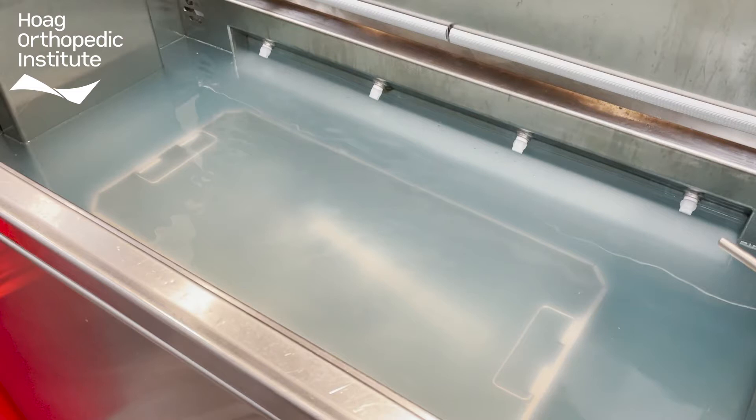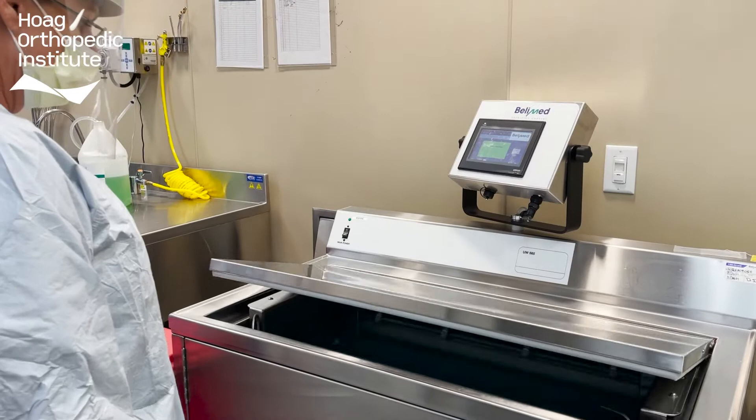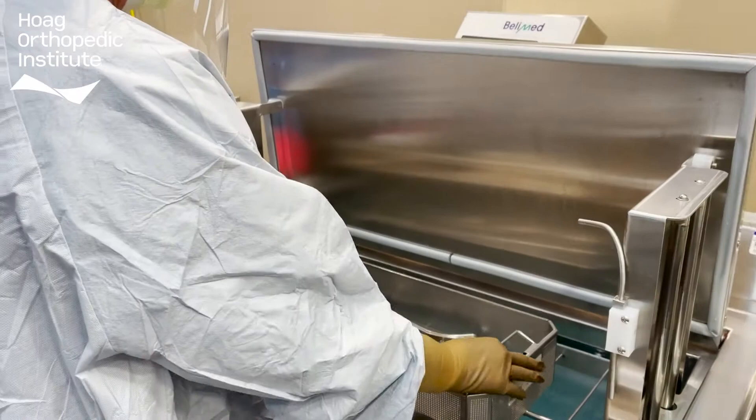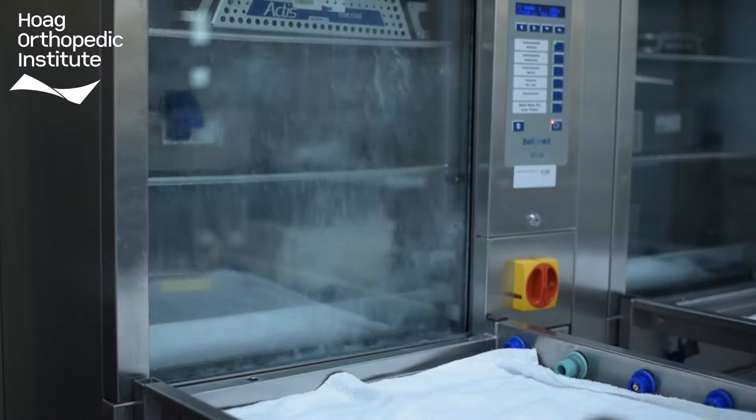Once all the biofilm has been removed, the instruments are washed and prepared for the final step of the decontamination process called mechanical cleaning. Mechanical cleaning is similar to a high-powered dishwasher. This step is implemented to remove anything that may be left on the instruments. The washer has spray arms that use detergents and high-pressured spraying water to clean the instruments. Each cycle includes a thermal disinfection so that the instruments are safe to handle.